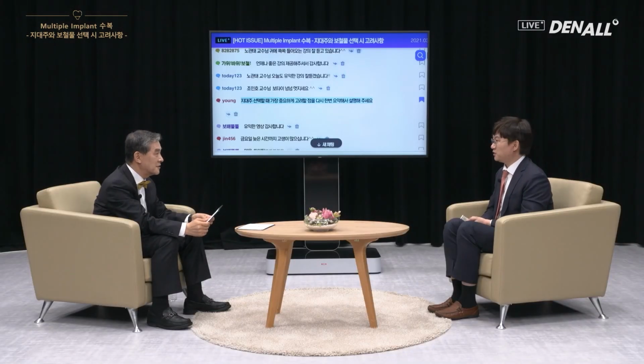We talk about the emergence profile, the divergence. Is there any criteria for the inclination or angulation of the emergence profile? I hear people are talking about the criteria of 30 degrees or 40 degrees, but the starting part can be slimmer, and it can get bigger subgingivally. Sorry for the interruption. You can continue.